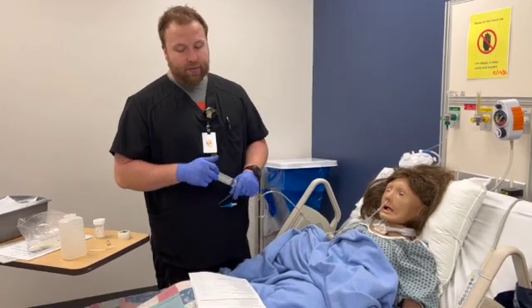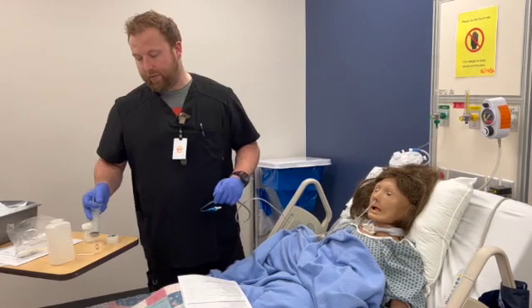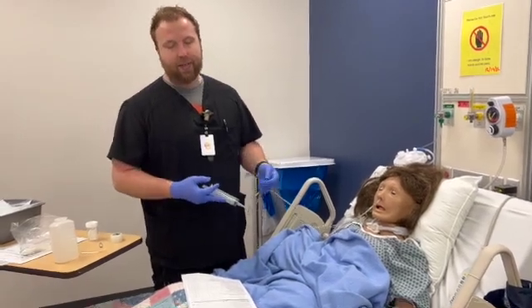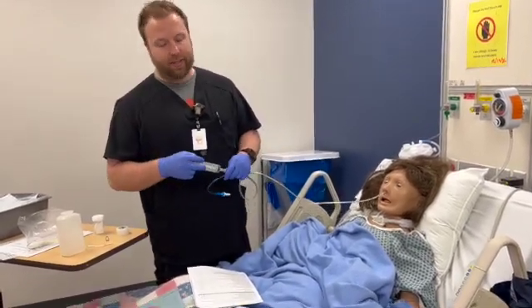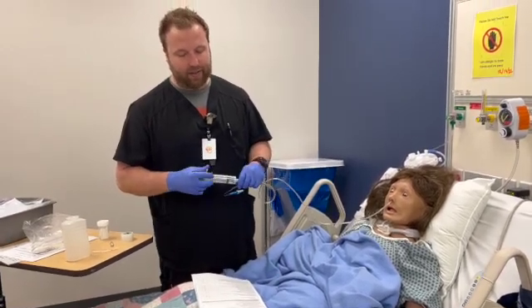The next thing we're going to do in this little box is we want to verbalize that the patient needs to go to x-ray while we do. On this sheet, the critical one is aspirating stomach contents. The most important one is our x-ray verification. That's the only way we definitely know where it's at.